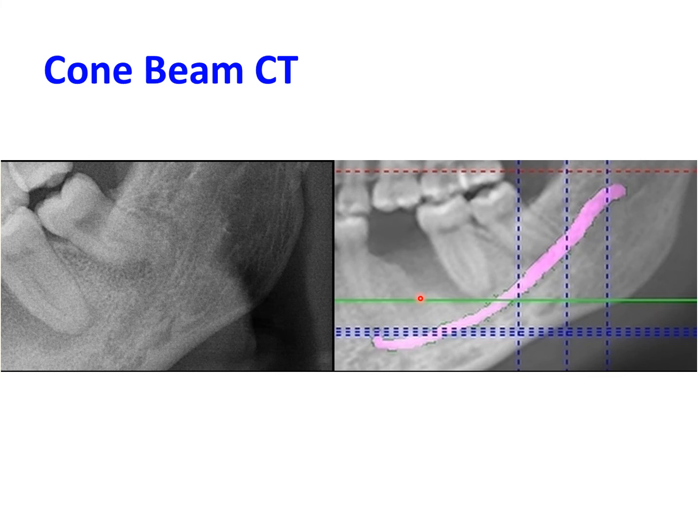So cone beam CT is only recommended if there are objective signs of a high risk of nerve damage on an OPG and an operative intervention is planned. If, for example, you observe deeply impacted wisdom teeth which are asymptomatic and pathology free in an 18-year-old and no intervention is planned, then there is no point in taking a cone beam CT.